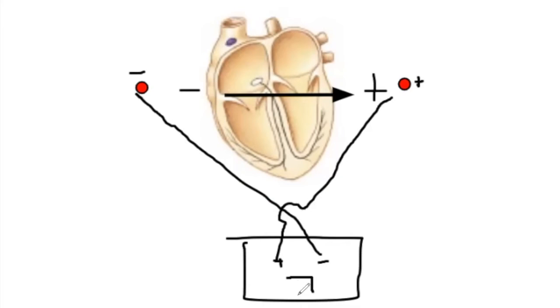What is this going to read out? Not in absolute terms, just what kind of voltage? Positive voltage, negative voltage, 0 voltage. Positive voltage. Why are you saying positive voltage? Yeah, the positive side of the dipole connected to the positive end of the meter. Okay. And the arrow is positive, so there's going to be more positive built up on that side. Right, so let's think about it.